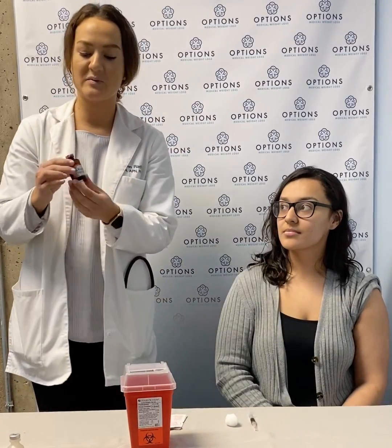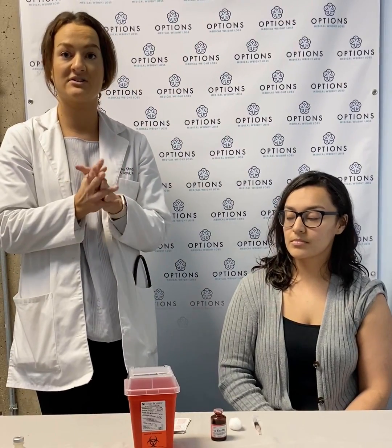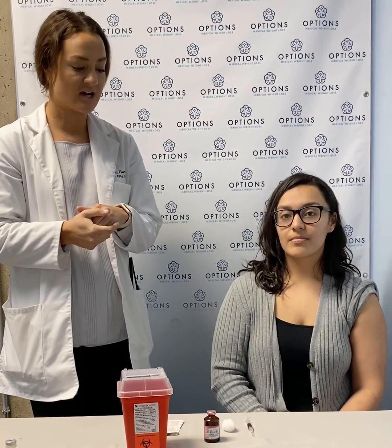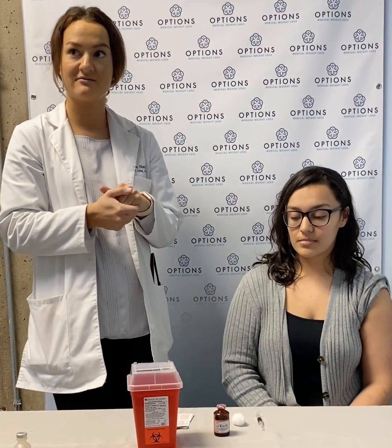This is the lipotropic in your vial. If you need help loading your syringe, there is a video on that, so please see that video. Here we are just going to talk about the actual injection of the lipotropic. So we have our pre-filled syringe here ready to go.